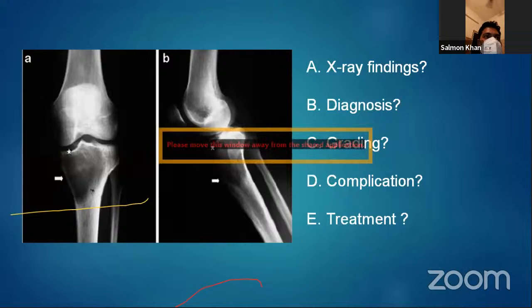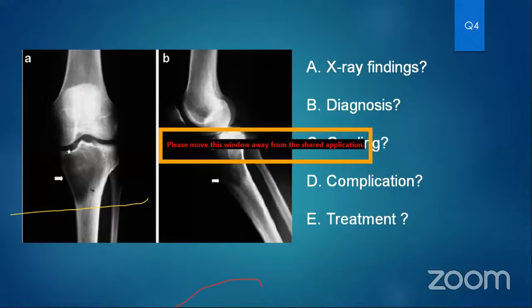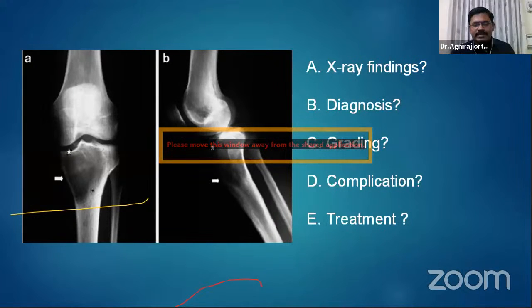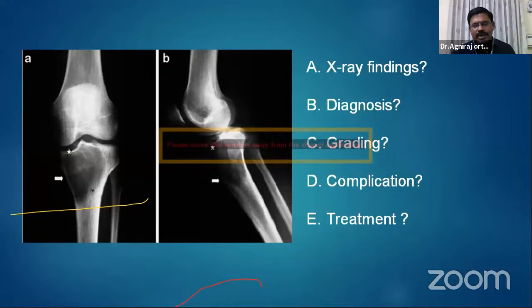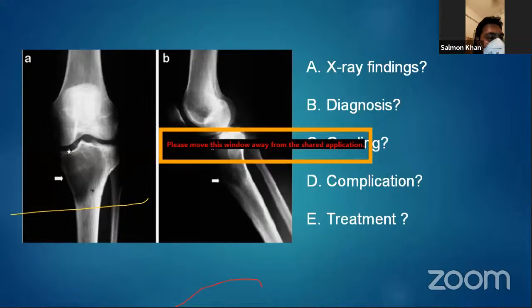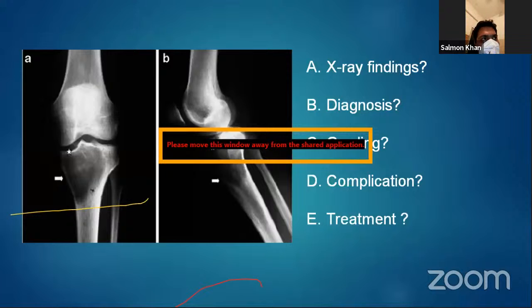If you come to the exam, you have to be a little more aggressive. Latent, active, and aggressive. That is generally the Enneking stage for benign tumor. Giant cell tumor comes under aggressive tumor, sir. Okay. So what is the treatment? Extended curettage. The answer is not complete. Extended curettage with augmentation with bone cement.